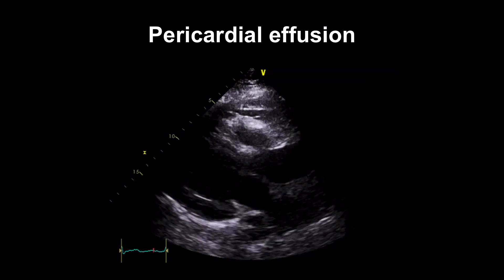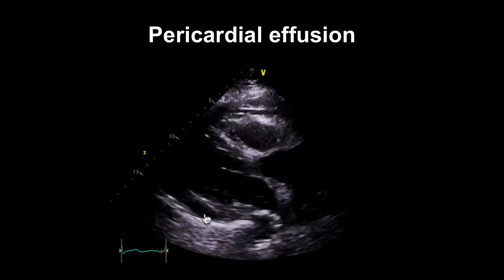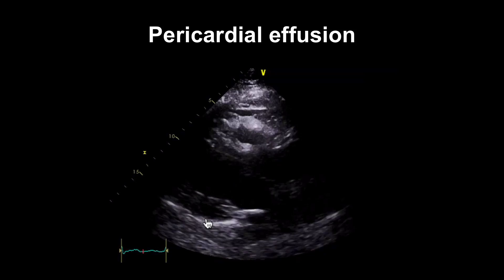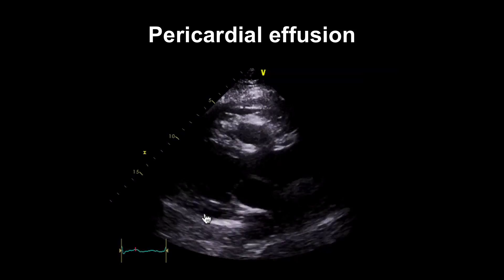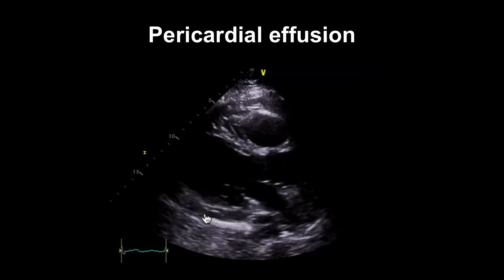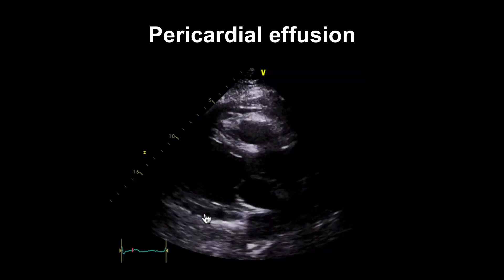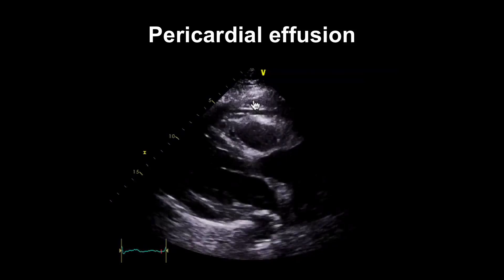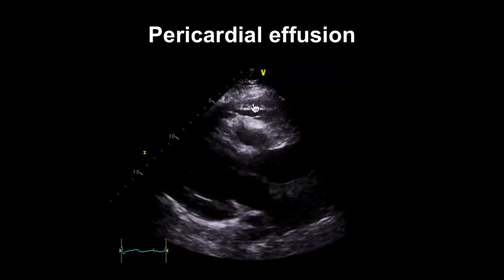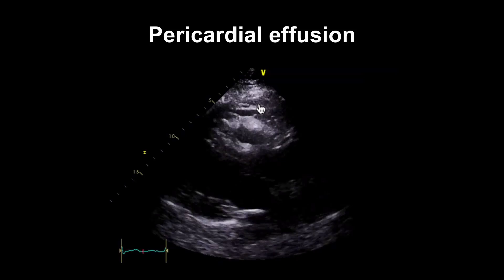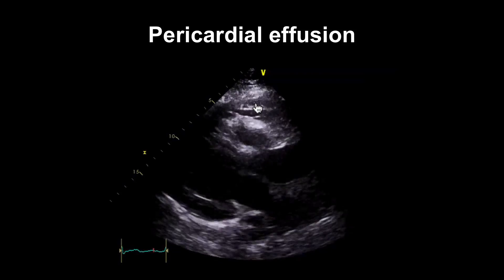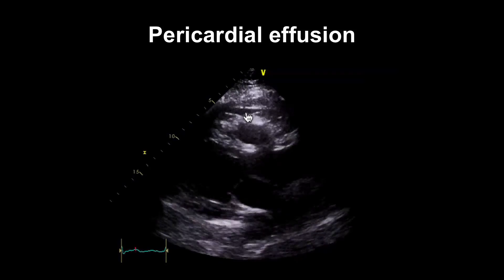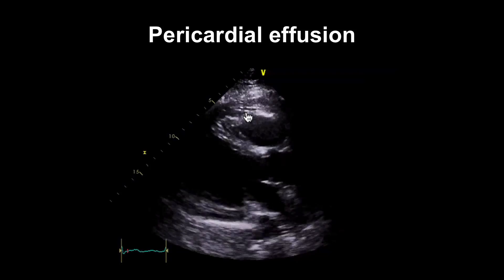This is what a pericardial effusion looks like on echo — it's this black layer here between the two layers of the pericardium. It may be blood, fluid, pus, or a combination; echo can't tell the difference. We also need to be aware of another layer outside that which looks like fat — we see this increasingly in our patients. Notice the echogenicity of that and how different it looks to the pericardial fluid.